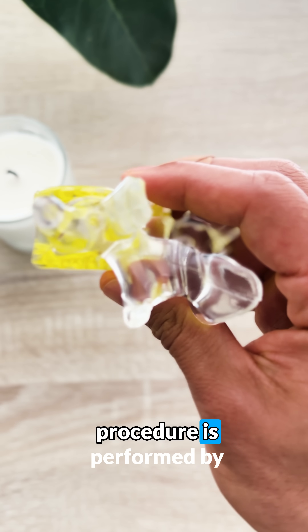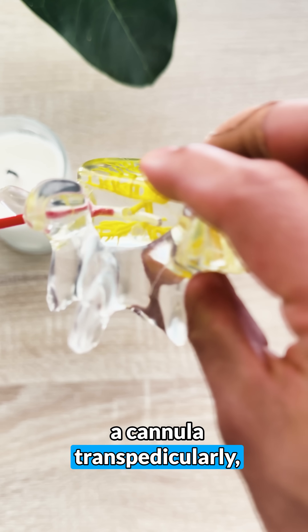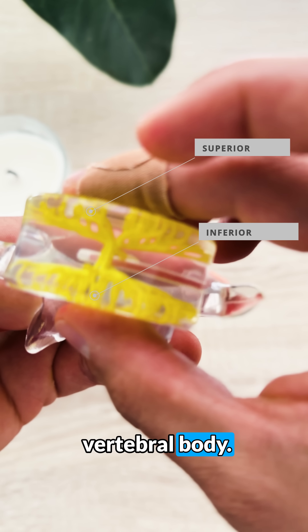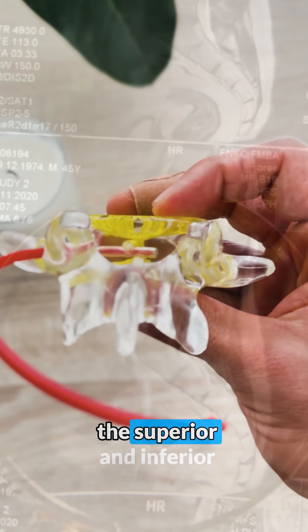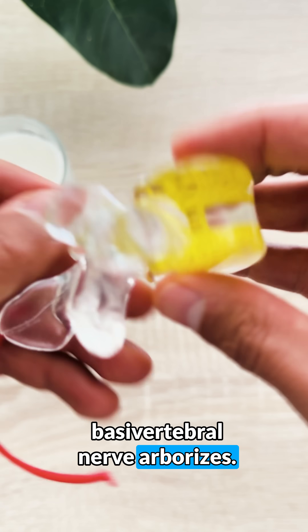The intercept procedure is performed by making a tiny incision over our target area, then carefully inserting a cannula transpedicularly under x-ray guidance, which you can see here as the red plastic enters into the vertebral body. We want positioning to be very precise, placing our probe around the posterior one-third of the vertebral body and halfway between the superior and inferior endplates, which is about the area that the basivertebral nerve arborizes.